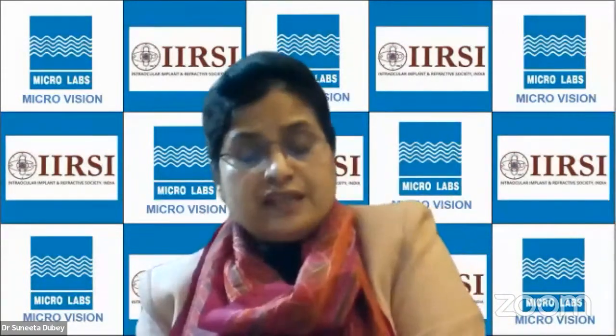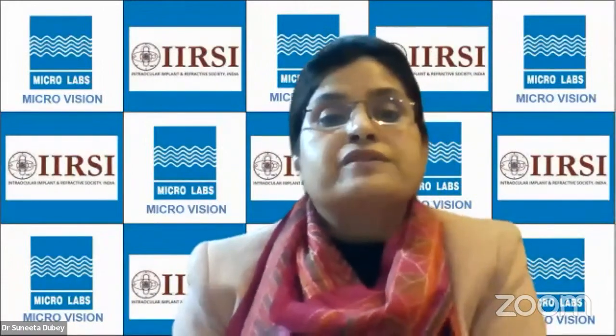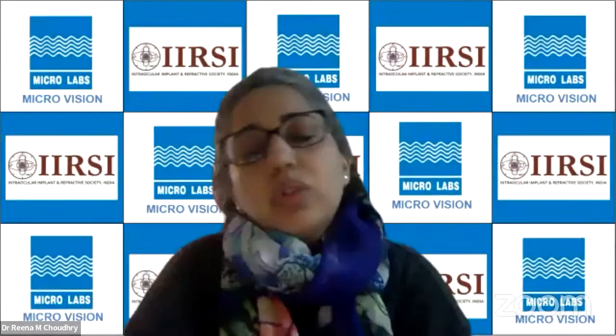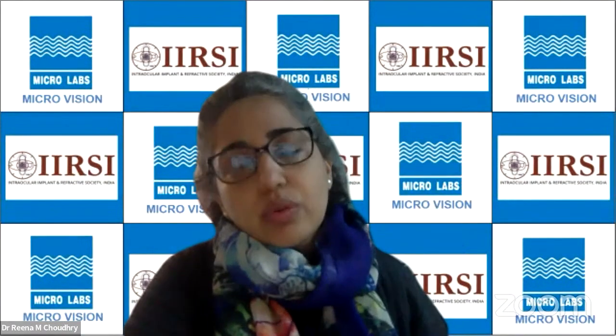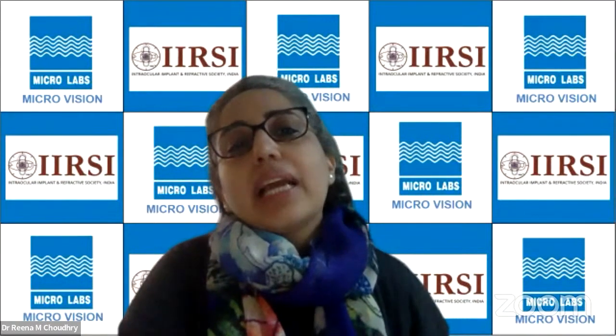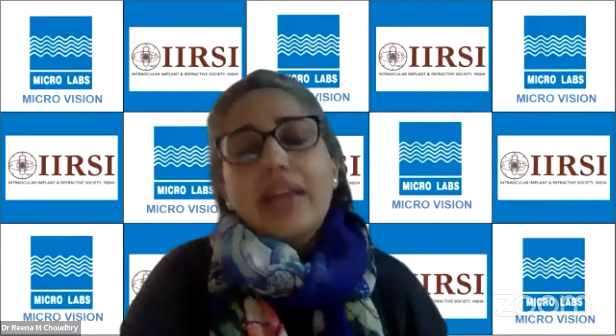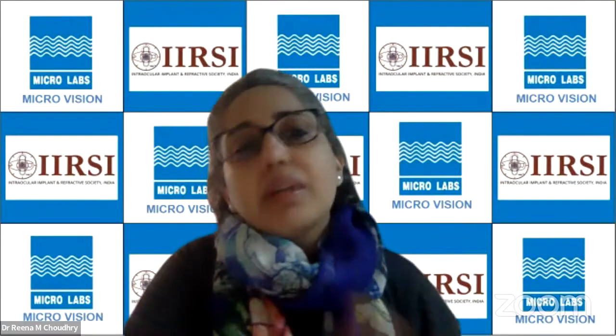Dr. Reena, do you have any different approach if you're dealing with the primary versus secondary glaucomas? Yeah, so I think Dr. Madhu pretty much covered everything, but two things I like to usually look out for. One is on the slit lamp examination. I like to see what the conjunctiva is looking like, not just how congested it is or how angry it is, but also the mobility in the superior area where I'm planning my trabeculectomy.